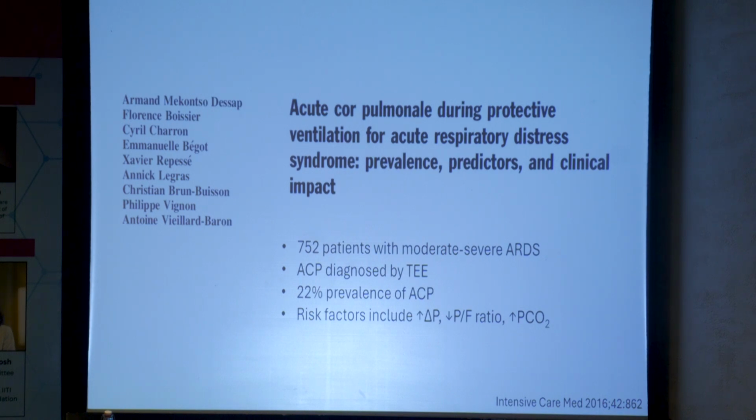For those patients who are there for months, do we need to change the cannula? No, you never need to change the cannulas unless there is a specific cannula problem or specific benefit from a different cannulation strategy. Deepak, how would you change it? We go to the opposite side, we go to the neck, from the neck we go to the front; you can put a new site. Yes, but it is really hard. Once you have dilated that vein that much, you can't keep it small. If you put a guide wire through it, it will bleed like nobody's business.